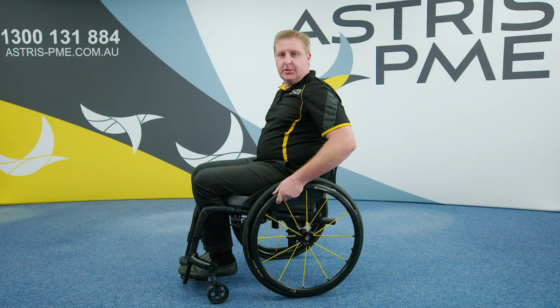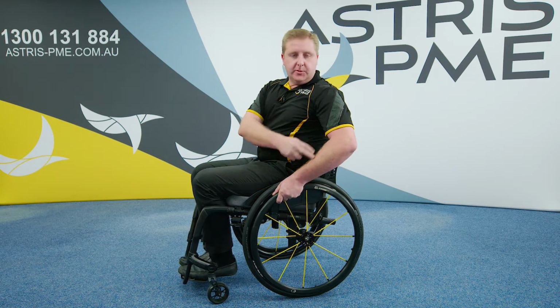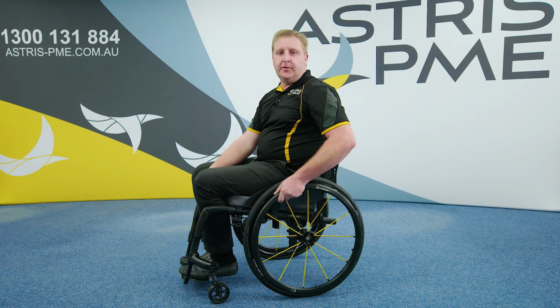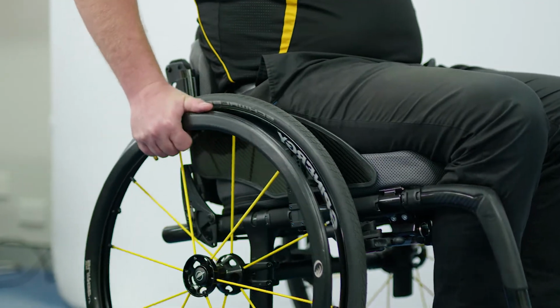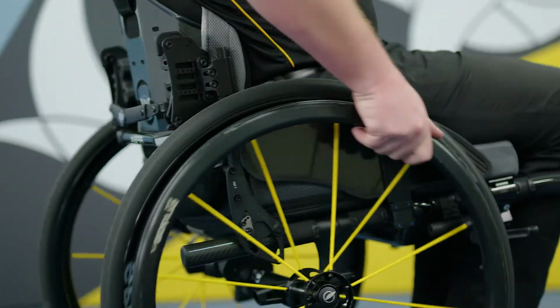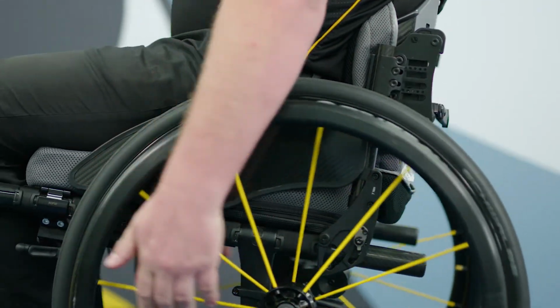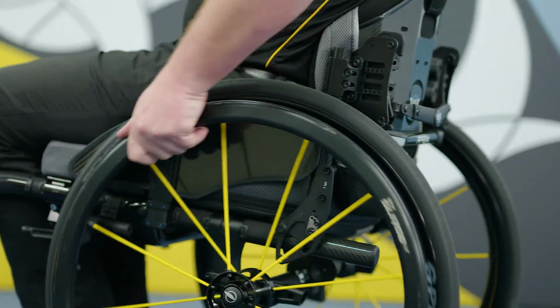Having your hand in this position and having the wheel set up correctly means that your elbow is between 100 to 120 degrees of bend. This enables a good push stroke on the wheel from this position back to here to push efficiently. The bigger the stroke and the more access to the wheel enables less shoulder wear and tear long term.